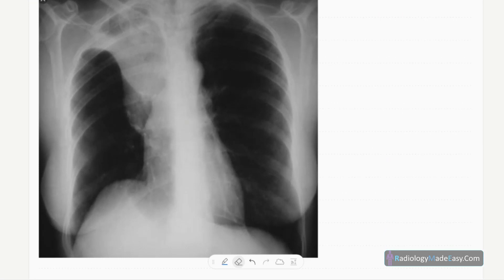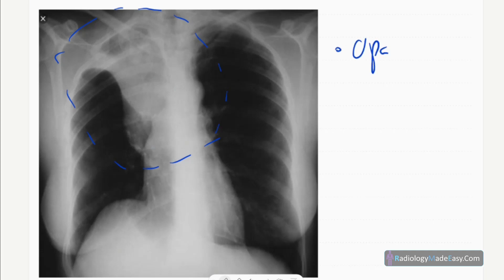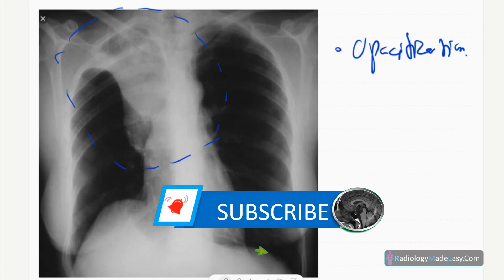This is the frontal chest radiograph of this mature female patient. You can see an obvious abnormality over the right upper zone. There is an inhomogeneous opacification projected over the right upper zone, including the right hilar region — so it's an opacification.